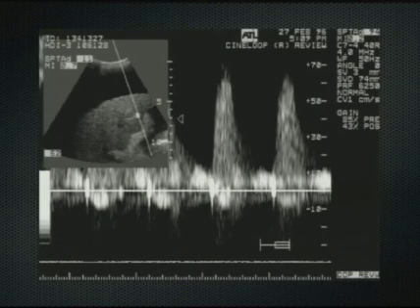If we look at an ultrasound image with a Doppler obtained from a segment within the image information, in this case the liver surrounded by ascites, is a display of the amplitude of the backscattered ultrasound energy. Stronger reflectors producing brighter echoes, and weaker reflectors producing darker echoes. This is all a display of the amplitude in the backscattered ultrasound signal. The spectral display, however, is based on the detection and analysis and display of frequency differences in the backscattered signal. These frequency differences arise as a result of the Doppler effect.